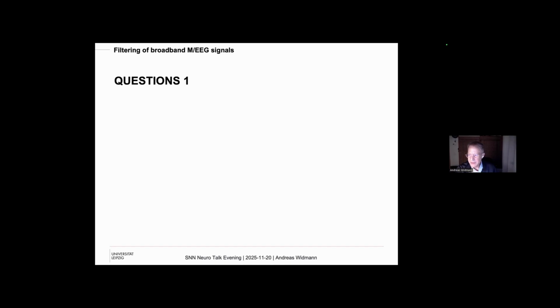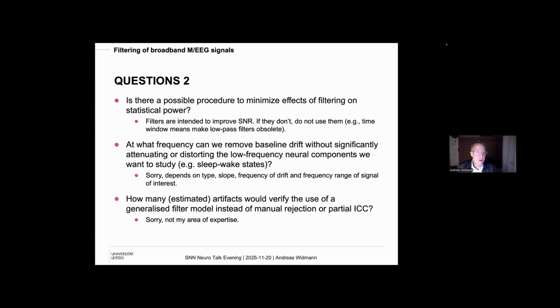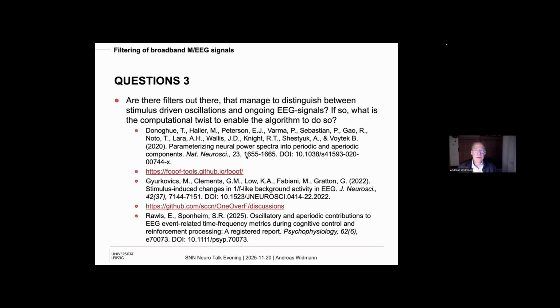You should be aware that you should remove large artifacts, so blinks, whatever. But that's basically the only thing I would do. It's indeed correct not to filter in the pre-processing of steady state responses. And if that was your question, I think that is then what you sent as a question, right?